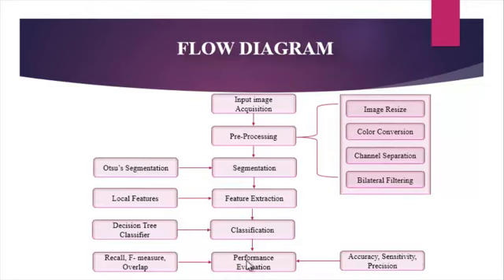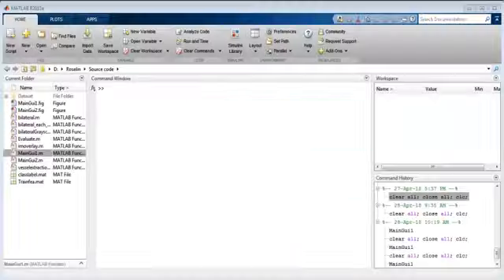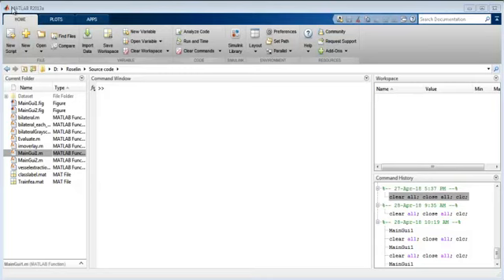In this proposed system, diabetic maculopathy is detected using image processing techniques. Now we can see how to execute the code. This process is done using MATLAB R2013A version. You can open MATLAB R2013A version.